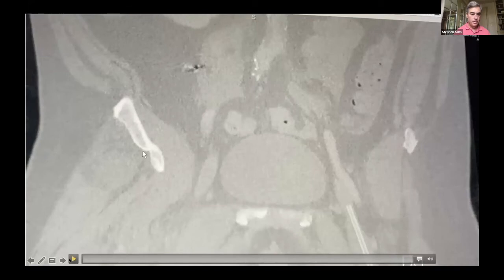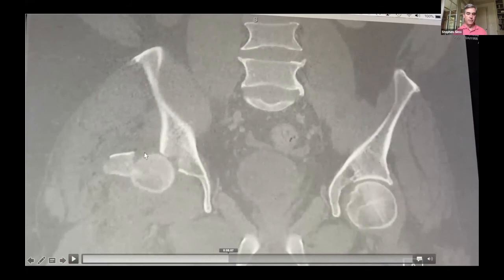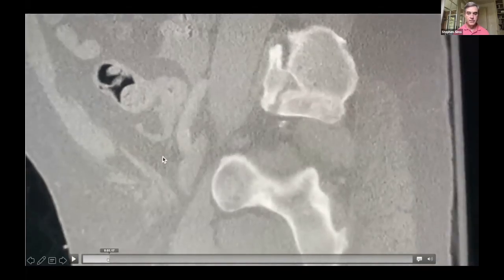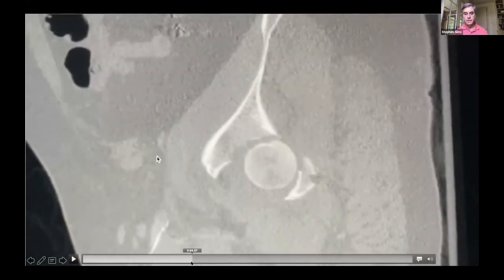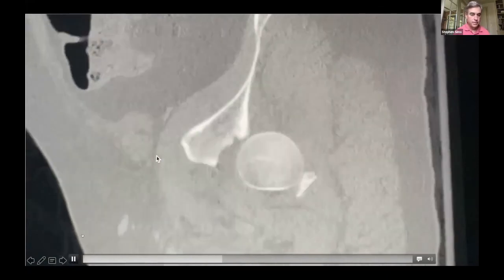Just to show you the coronal views as well, that we looked at one cut on, we can scroll through that. Again, you can see the dome of the acetabulum up there, and you can see the head and the defect where the dome of the acetabulum used to be, and the small remaining portion of the acetabulum. And then finally, the sagittal cuts, which basically give you the idea of how far anteriorly this comes around. When we get out toward the periphery of the acetabulum, you can see what remains, which is just that little tiny bit of articular surface. So any fixation we put in, or any idea to see the anterior part of this fracture, means we're going to have to go all the way basically to the anterior inferior spine to be able to see that part of the fracture.